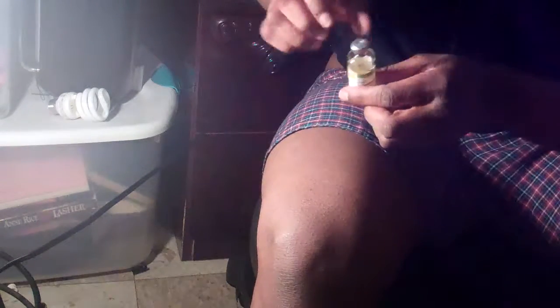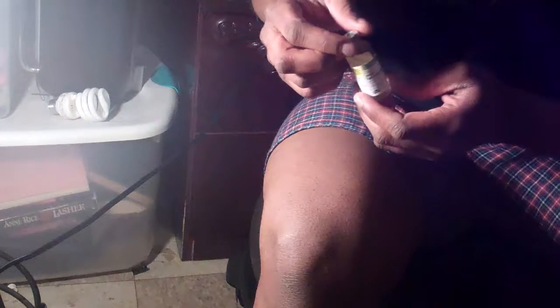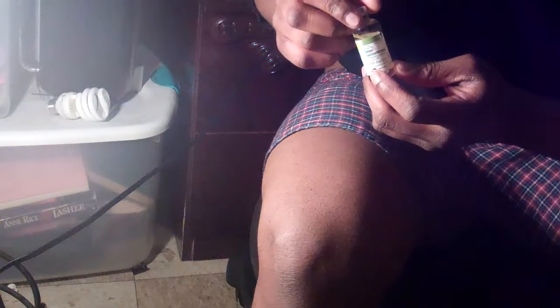Alright, so the first thing I'm going to do is get my T and flip off this little cover here. This is the first time I'm doing this alone, so you're going to learn with me. This is my vial, which is 100 milligrams per milliliter. That means since I'm at 50 milligrams a week, I'll be taking 0.5 milliliters.